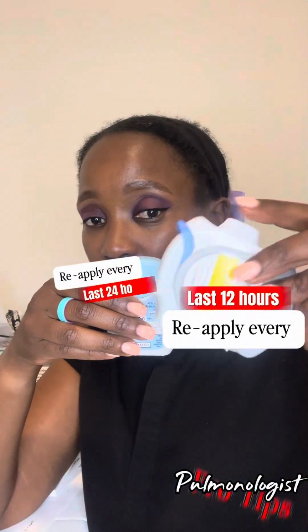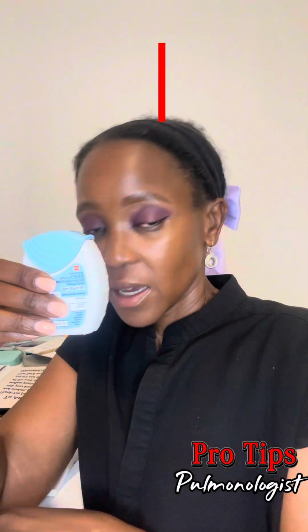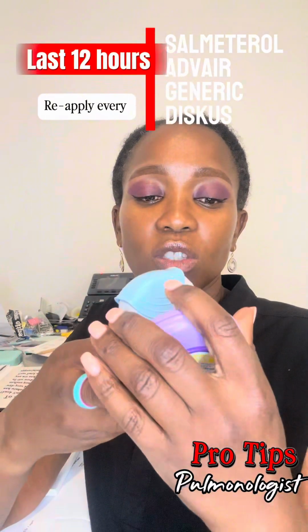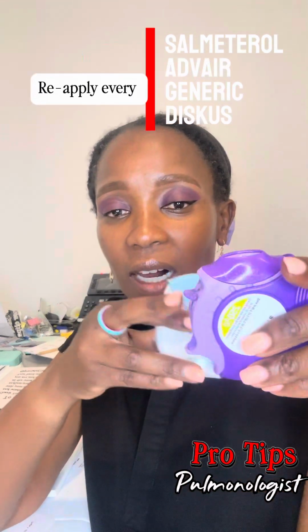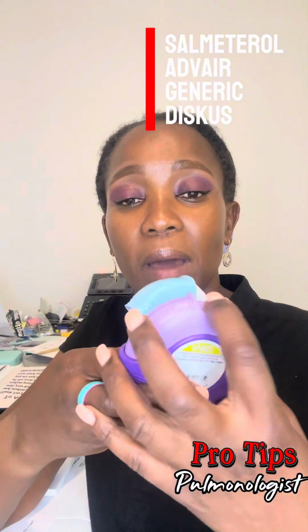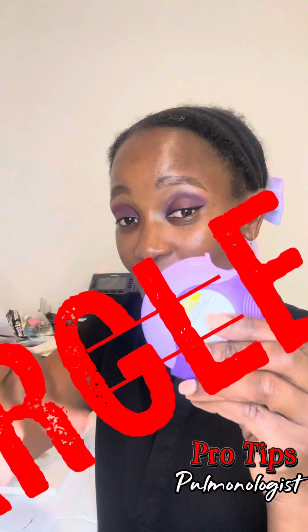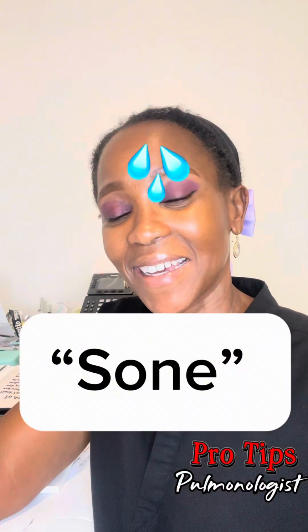Very different compared to these, which you have to trigger, and you will not waste these, because once you open them, as long as you didn't click them, you can close them back up, but not for these. So be very careful. You do need to rinse your mouth after this. You need to rinse your mouth after this one. You do need to rinse your mouth after this one. And lastly, this one. Why? Because they all have a steroid inside.